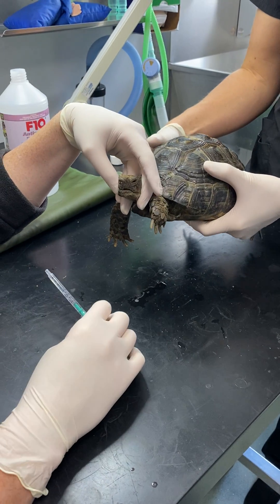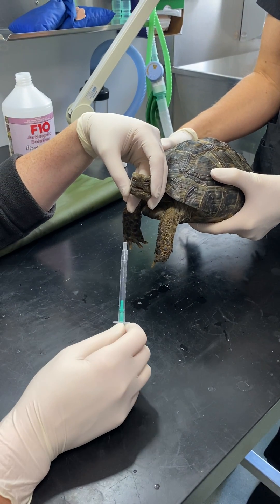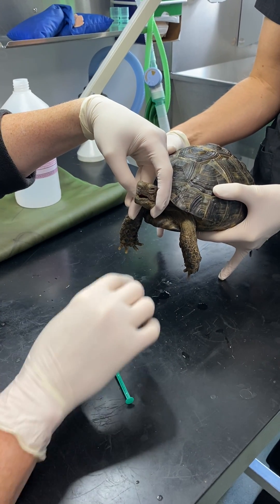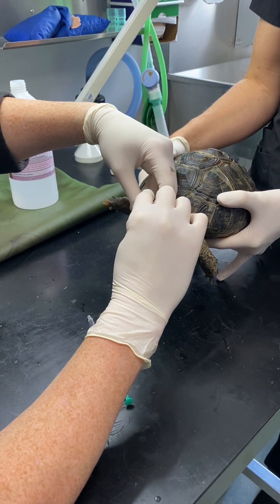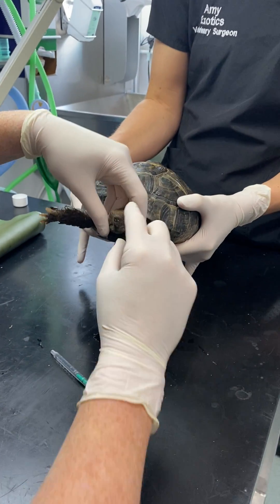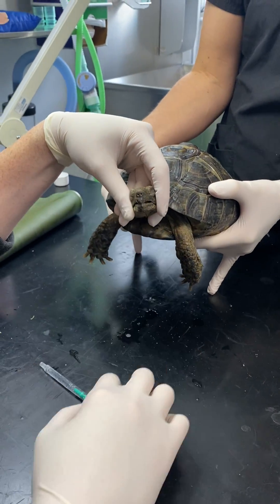Today we're going to show you how to do nasal flushing in a tortoise. We do this a lot in tortoises with upper respiratory tract disease. It can help clear some of the mucus but also help treat the underlying issue too. This is a little girl that's got quite a bad upper respiratory tract issue — she's got some nasal discharge.